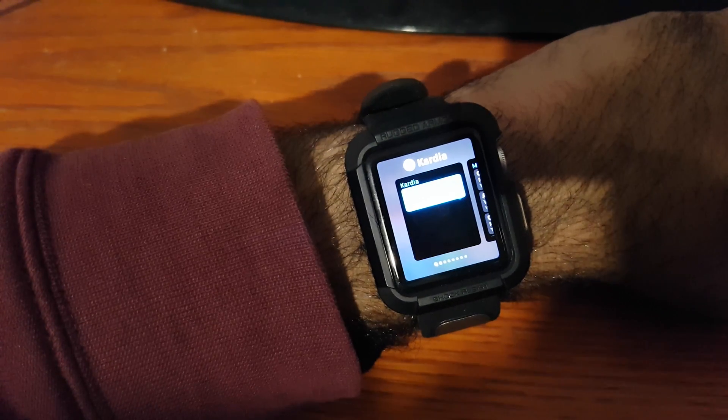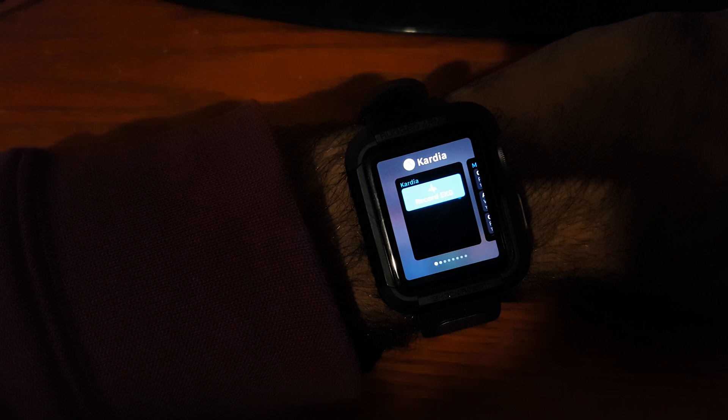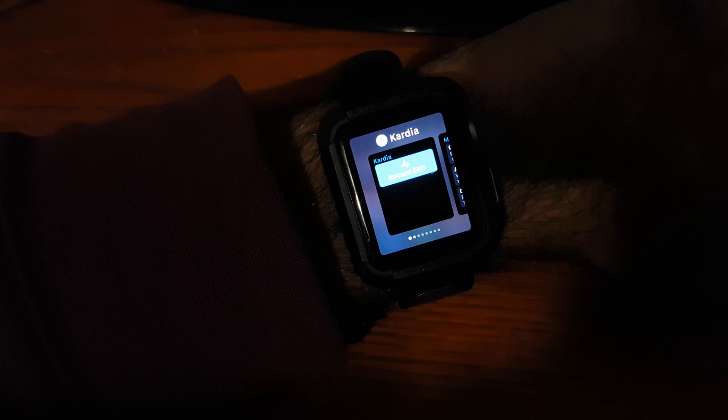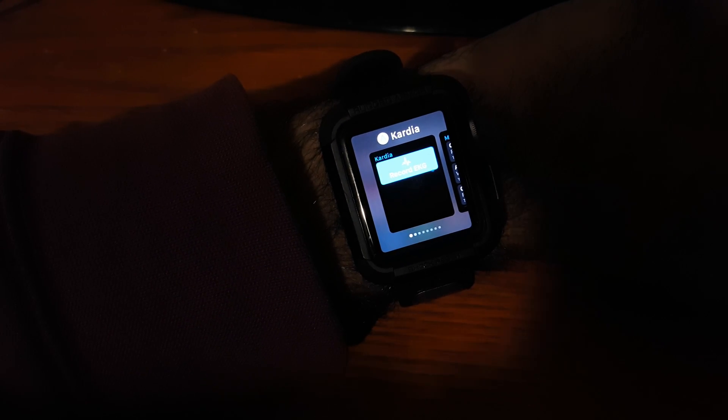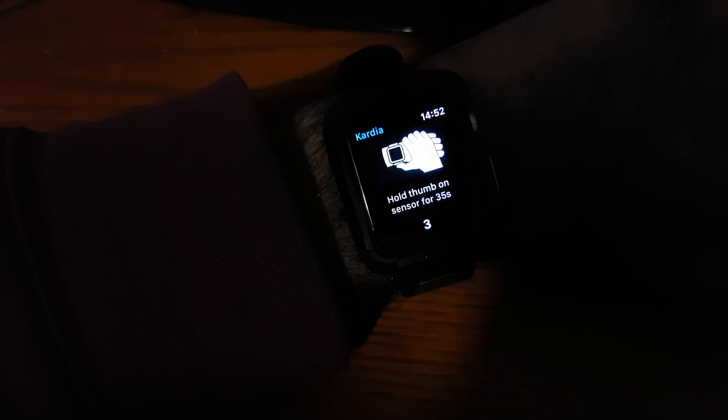Let me just adjust exposure, so it's a little bit easier for you to read there. And let's see. So now then I just tap here, and I just tap on record ECG.